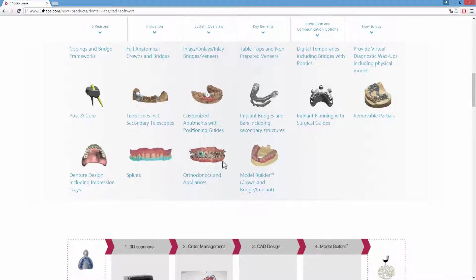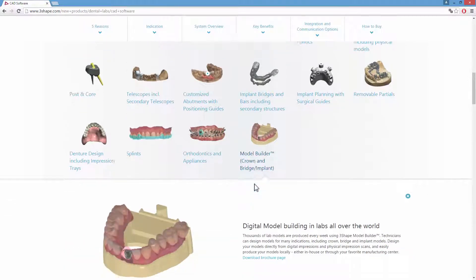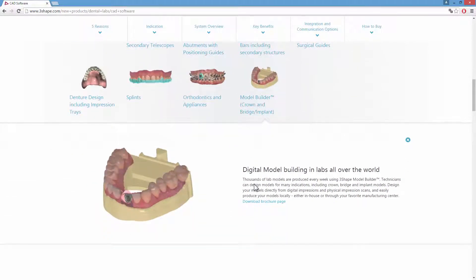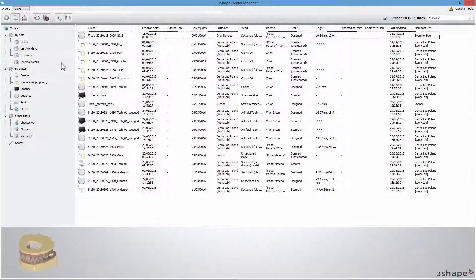With Model Builder, you can choose between two different ways of making a model: with analog interfaces or abutments as dies. In our example, we will show you an abutment case.